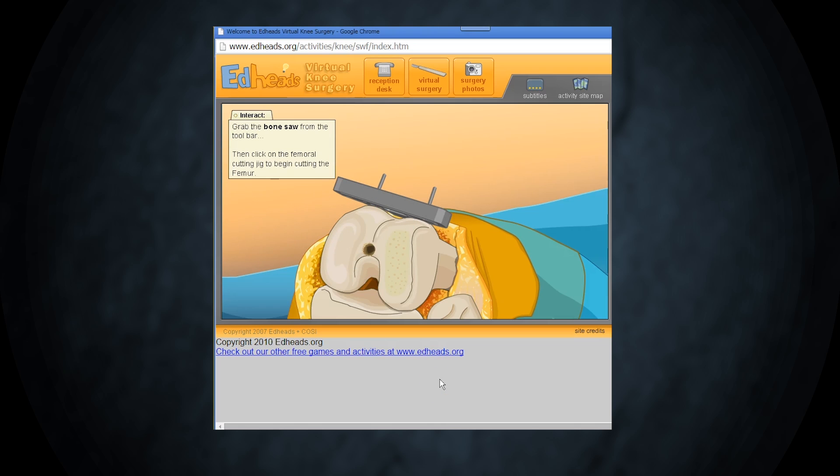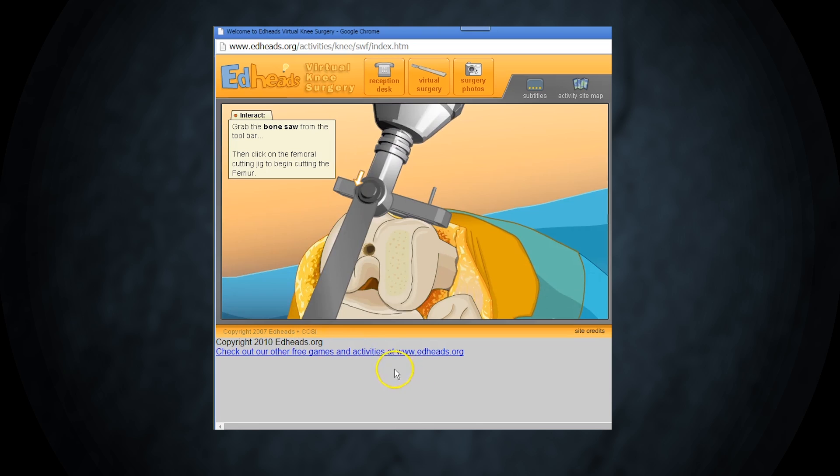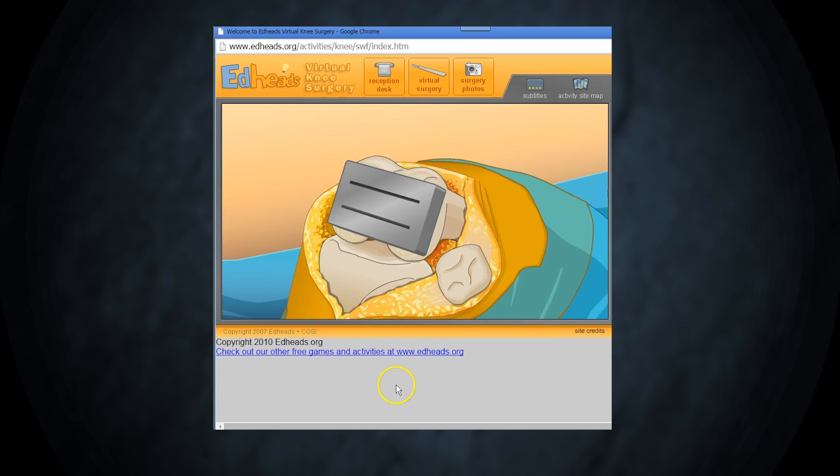Now for some real bone shaping. Use the bone saw to cut the bone so it is prepared for the new femoral component. Another cutting jig along with the bone saw allows us to finish shaping the femur.